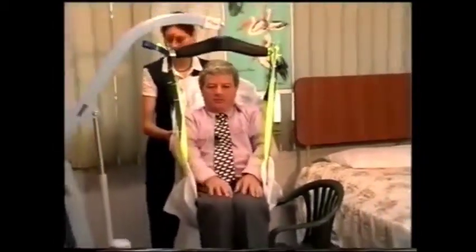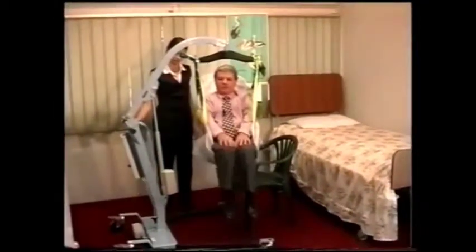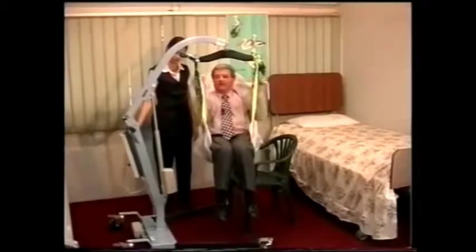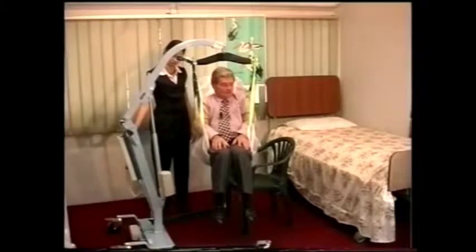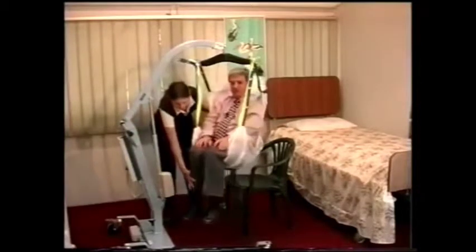So this is the hammock version of the sling. Difficult to get in if you want to wash in between the legs. A bit difficult to get in like that, but otherwise a very comfortable sling. And you know, I can hold on to this, put my hands down there. If I was a hemi, I'd have my arms inside. But it works in a comfortable manner. I can support my own head. If not, I'd be lying back like this. With some people, you might like to put a small pillow in behind the head, which would make them more comfortable. So if you'd like to lower me down again now, Vicky.